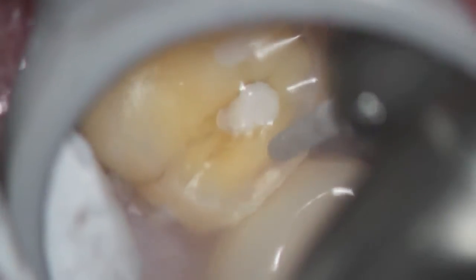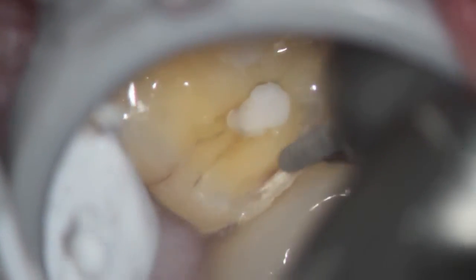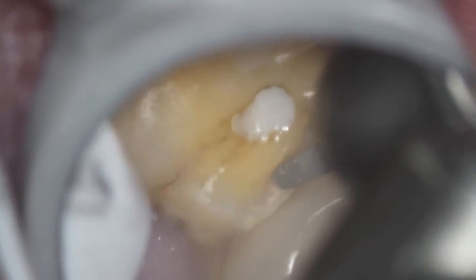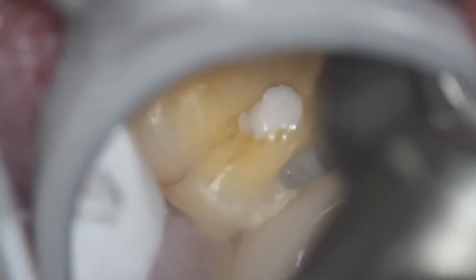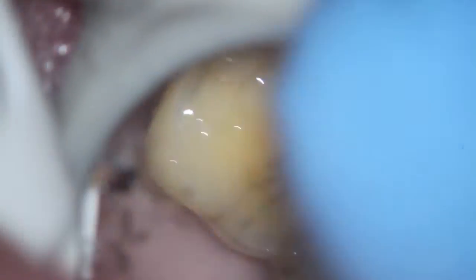Therefore you don't need to remove as much tooth, and you're just going to see the end part of the actual preparation. We're removing the interproximal area so that the onlay will touch the teeth and have no difficulty seating.